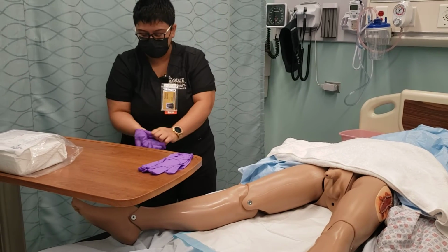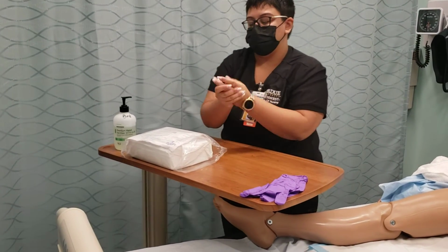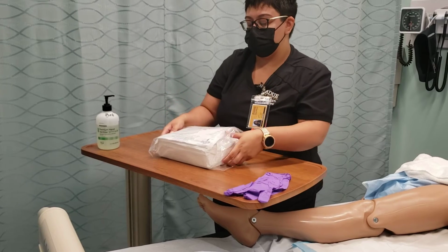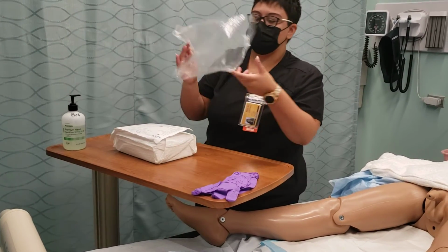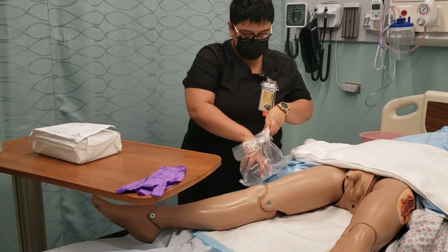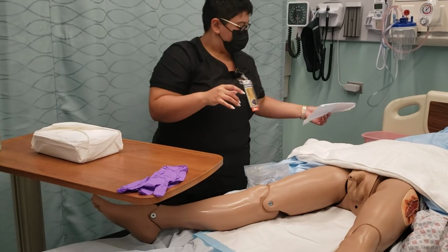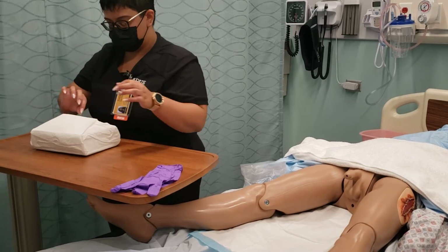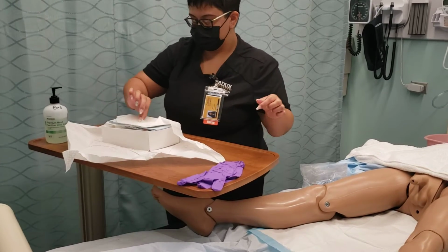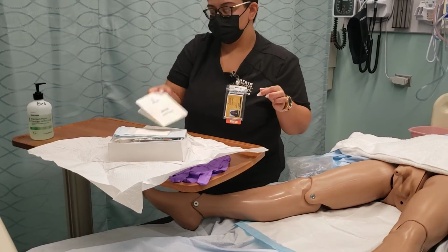Next, I will remove my gloves and perform hygiene again. And then set up my Foley catheterization tray. I made sure that it's not expired, it's latex free, and I will not be using the iodine that's in it today. So I'm just going to take my bag here. Now we have the patient brought right out. So we'll be able to do the procedure and expose just enough. And now I'm going to put a big towel on the patient. My water basin. And grab my sterile gloves.